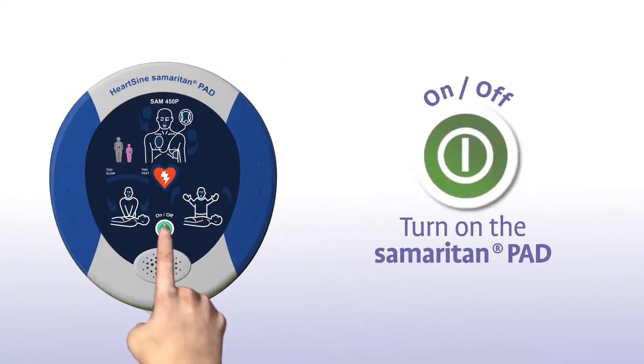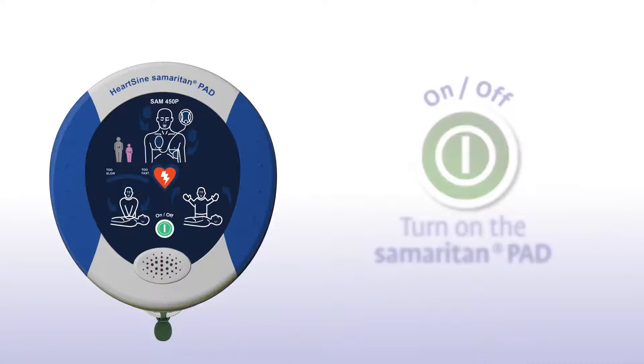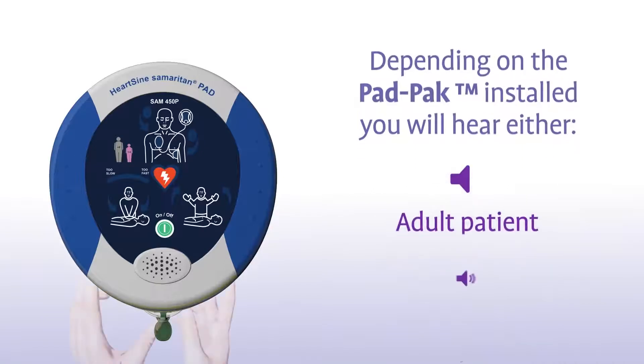Press the green ON-OFF button to turn on the Samaritan PAD. Depending on the pad pack currently installed, you will hear either an adult patient or a child patient prompt.